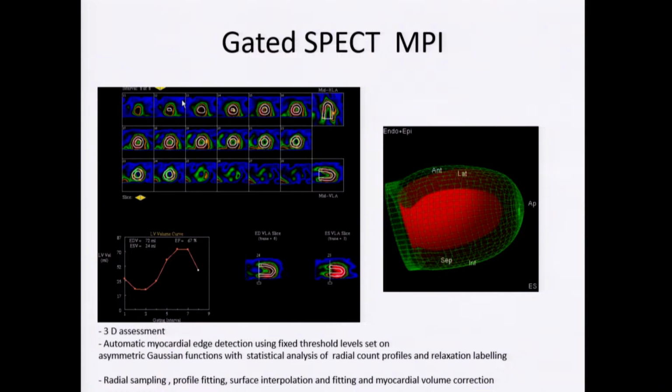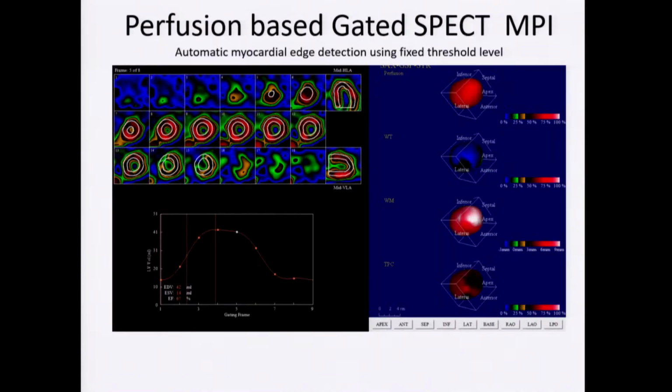Essentially, you can look at these really crude images, compared to MRI or CT, but the amazing thing is, clinically, it's actually very useful. So I'll show you an example of a normal one, and this will be an abnormal one, okay?